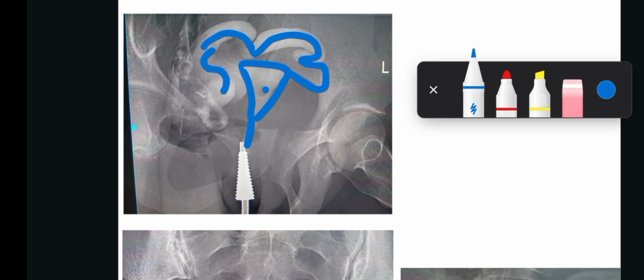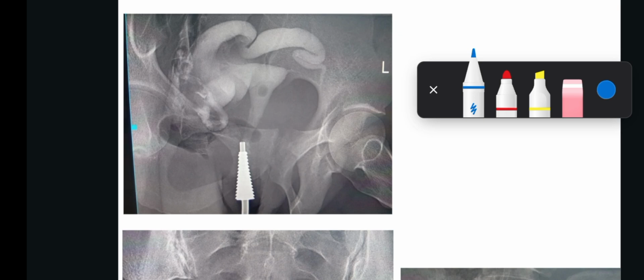That is the tube. It is a dilated tube. Hydrosalpinx is a tube that is distended with fluid, and this fluid could be water or pus. Then we'll see this other, the right tube here. You can see this is the right tube.